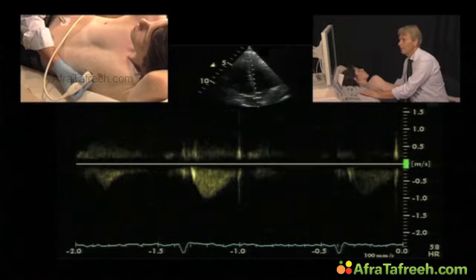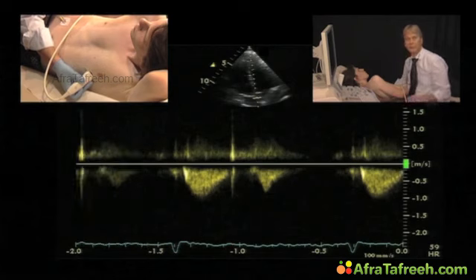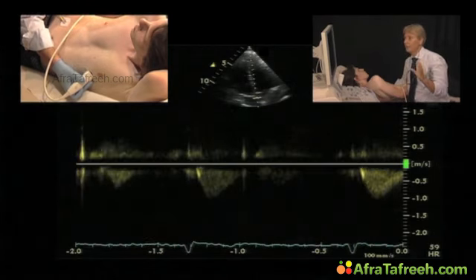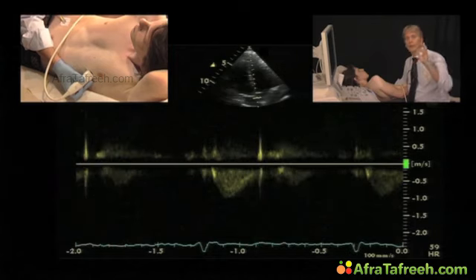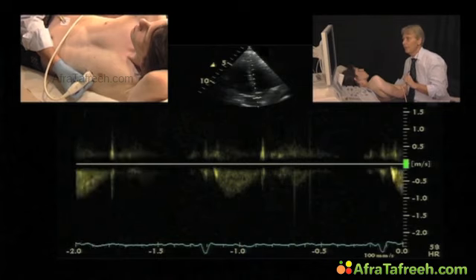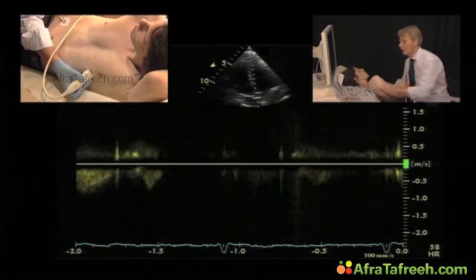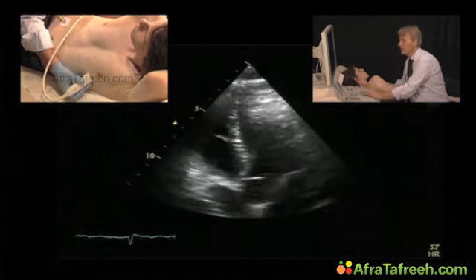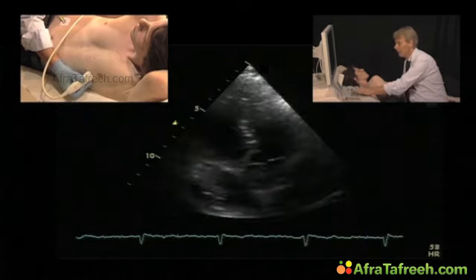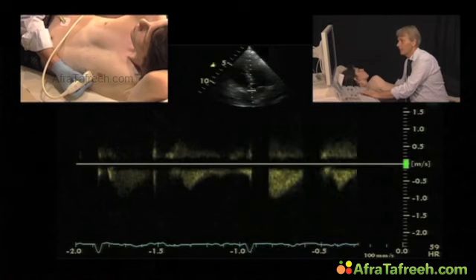And the only difference you have here is you do not have a sample region of interest, but you have a focus region. And this focus is of importance because if you move this focus point, you will all of a sudden get a worse quality of the signal. I'll demonstrate this here. Right?